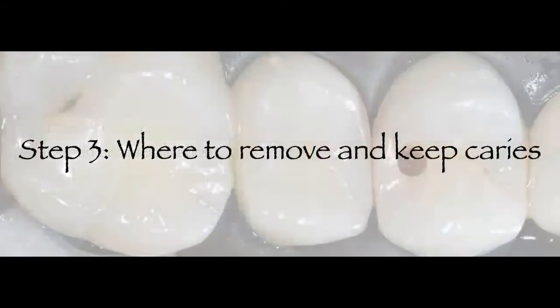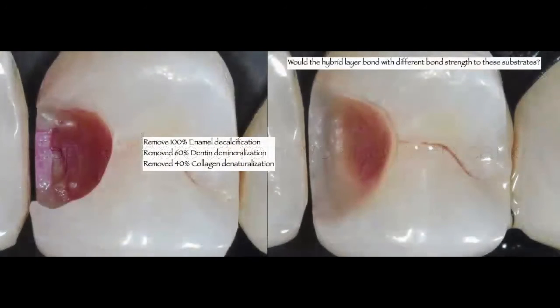And that's going to be my third tip, or my third step, which is where do I remove and where do I decide to keep caries? So we know how to separate the teeth. We know how to identify these layers. Now, how do I remove them?